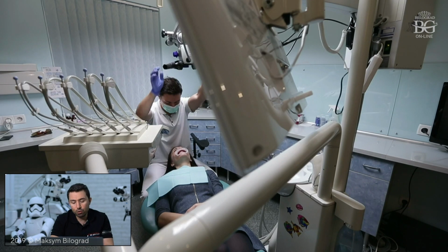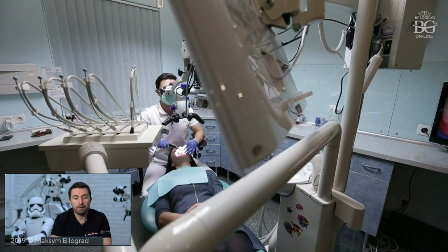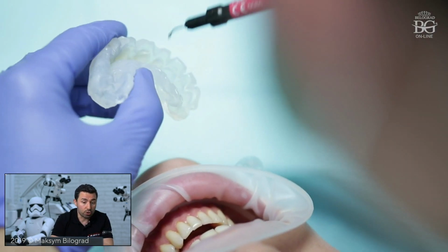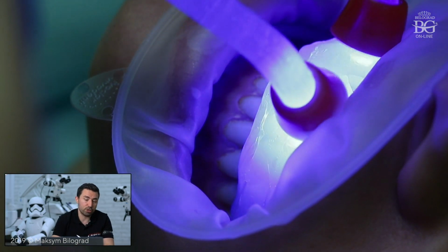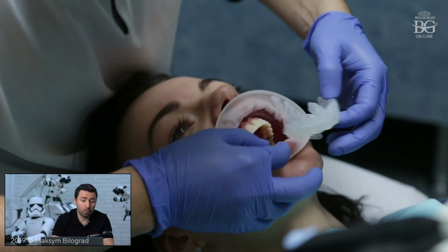In that case, I used a transparent silicone index for the aesthetic mock-up, because at that time I didn't have bright colors of bis-acryl material for the mock-up. It was only A2 or A3, and we would like to see the BL shade, let's say. So I used a BL flowable composite, and then we made this mock-up.